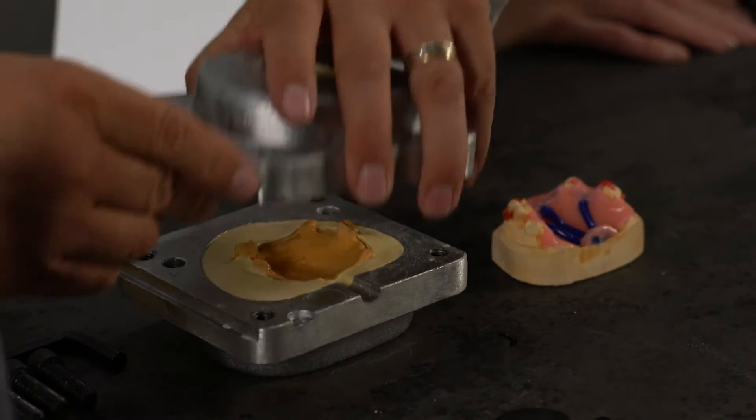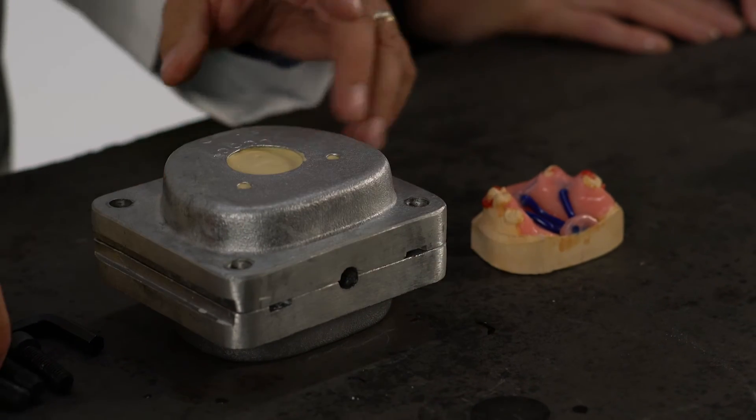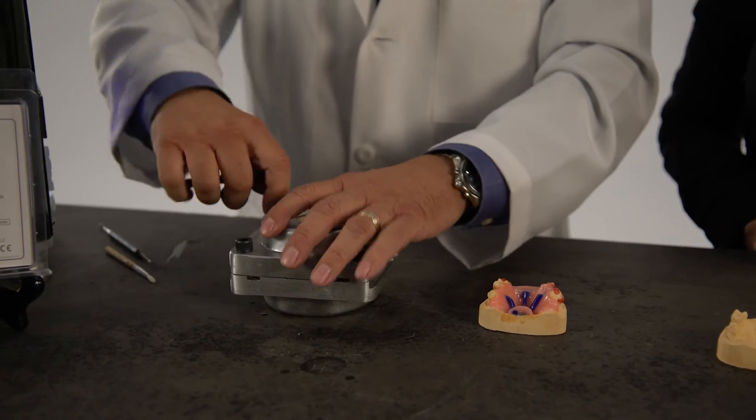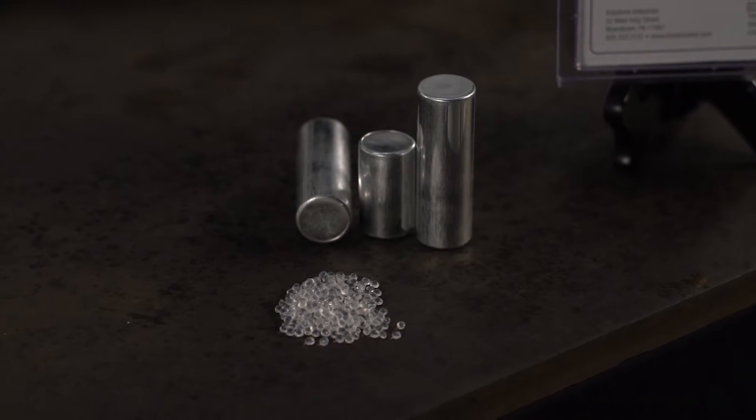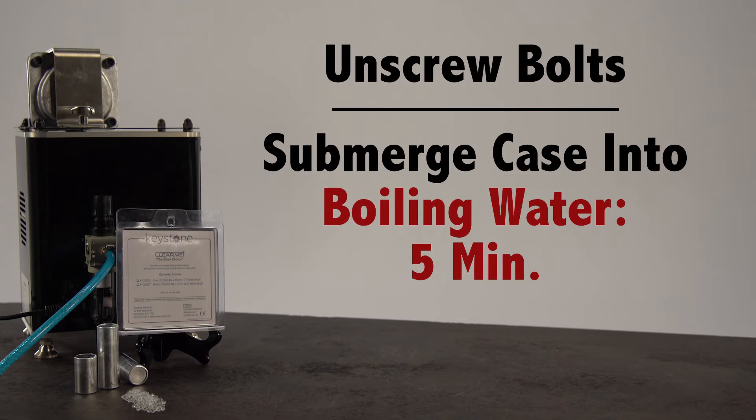Next, apply petroleum jelly to all the gypsum areas, screw down the top half of the flask, and vibrate the stone into the top section of the flask. After the gypsum sets, the case is ready to be boiled out.